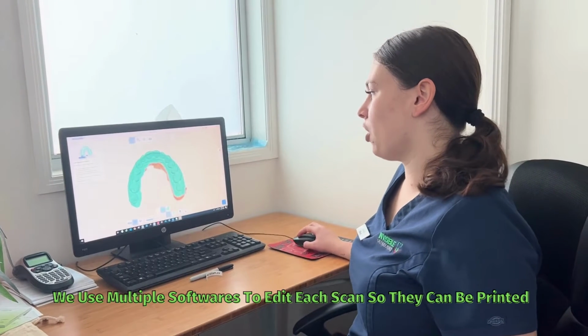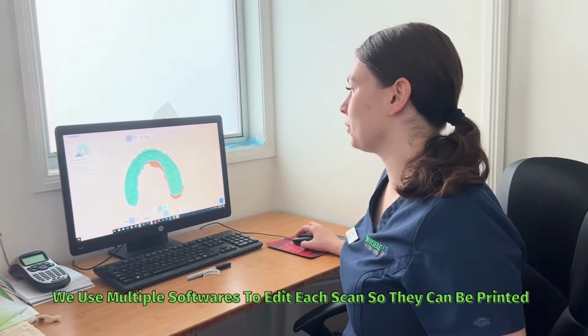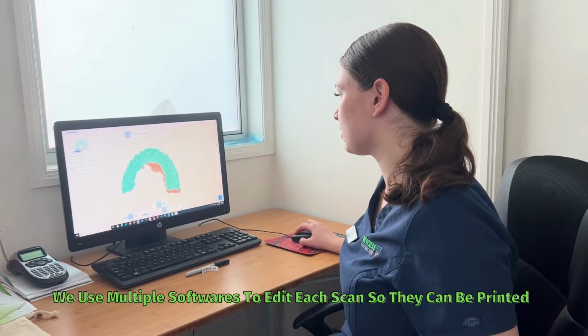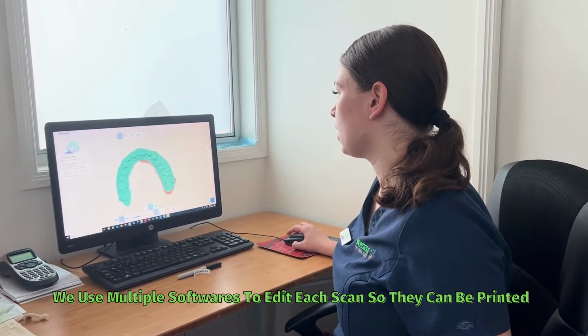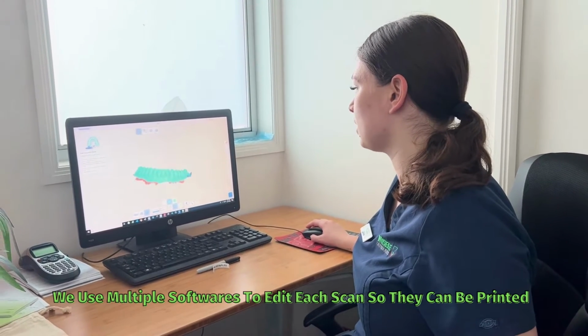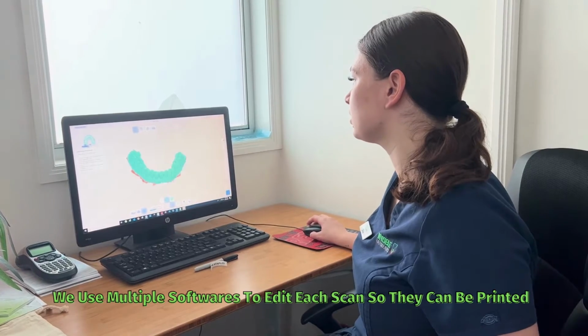So we edit it on a software called Model Builder, which is by Medit, and the first one we do is the uppers. So we just go in and fill any of the gaps, and then we can move on to the lowers and do the same thing here, making sure that it's all covered.